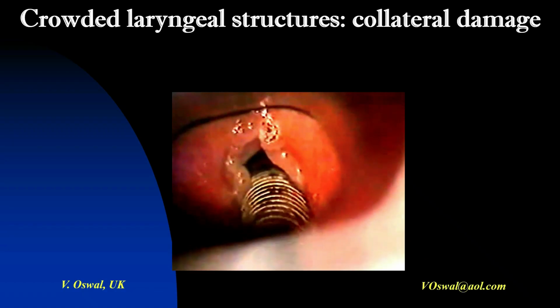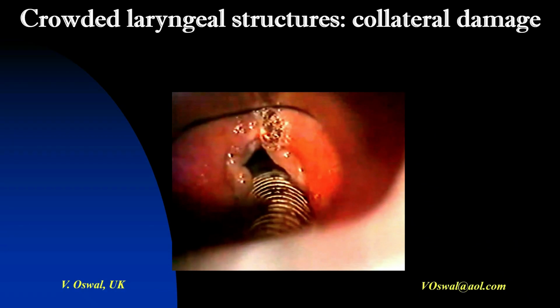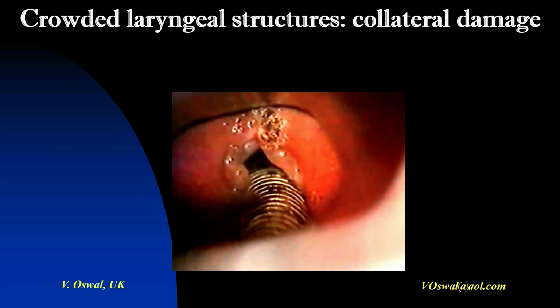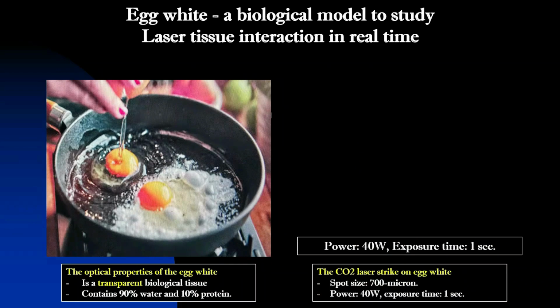My final concern about using the laser in the larynx was the power setting. The spread of the thermal energy to the vocal fold may cause scarring and lead to a poor vocal outcome. One day, I was watching an egg being fried. It gave me an idea.